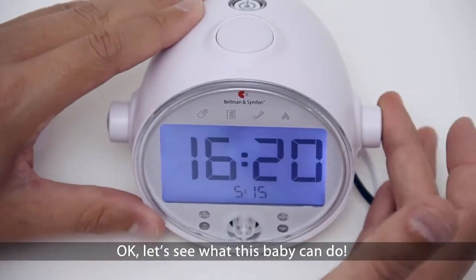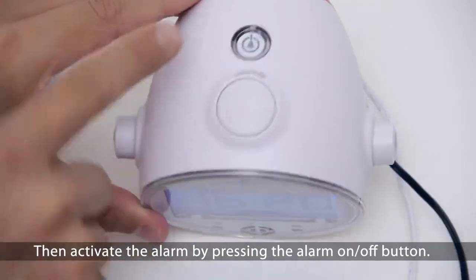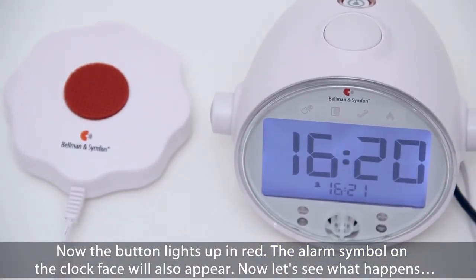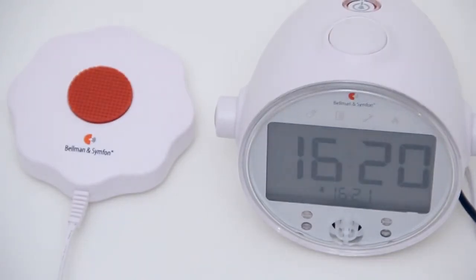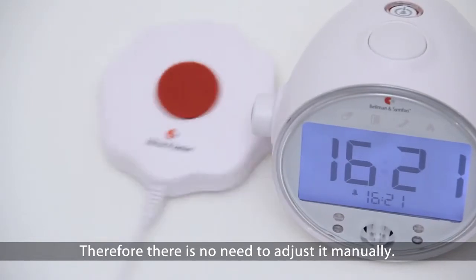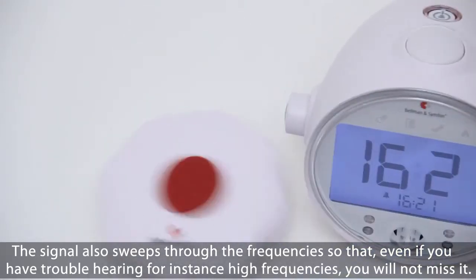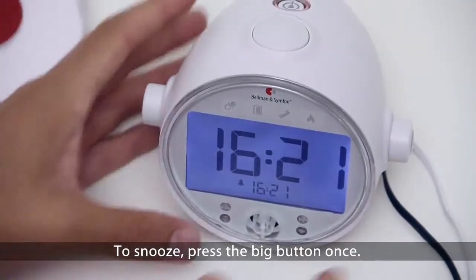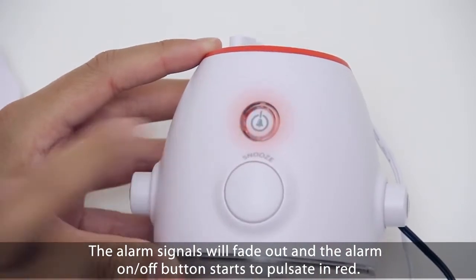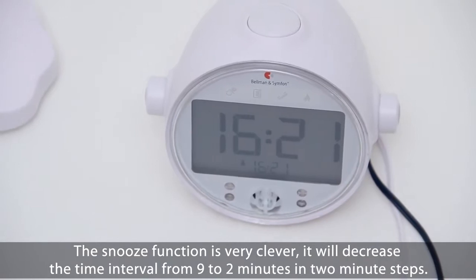Let's see what this baby can do. First set the wake up time as we just learned, then activate the alarm by pressing the alarm on/off button. The button lights up in red and the alarm symbol on the clock face will also appear. The volume increases gradually and reaches over 100 decibel in the end, so there is no need to adjust it manually. The signal also sweeps through the frequencies so that even if you have trouble hearing high frequencies, you will not miss it. To snooze, press the big button once. The alarm signal will fade out and the alarm on/off button starts to pulsate in red. The snooze function is very clever — it will decrease the time interval from 9 to 2 minutes in 2 minute steps.